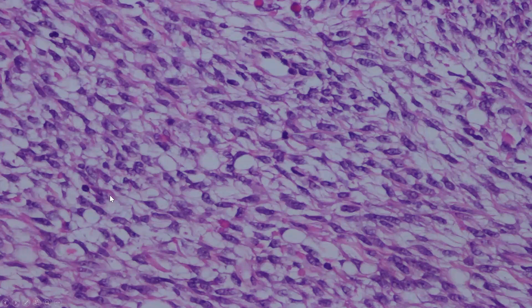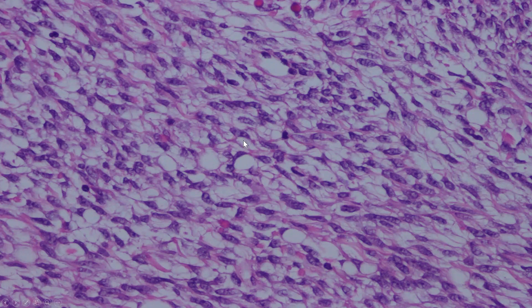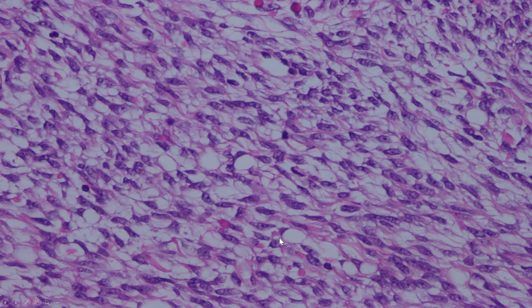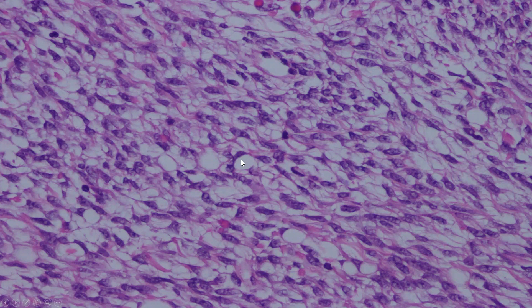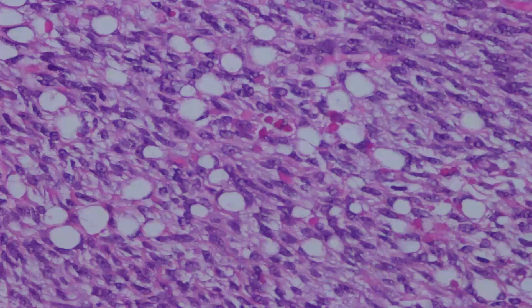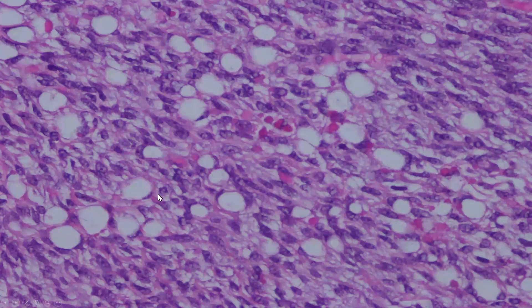Zooming into the dark areas, as you can see, there is a proliferation of cells with some tendency at signet ring formation. This is a single cell with a single vacuole and an eccentrically placed nucleus that is pushed to one side, very much reminiscent of signet ring carcinoma of the stomach.